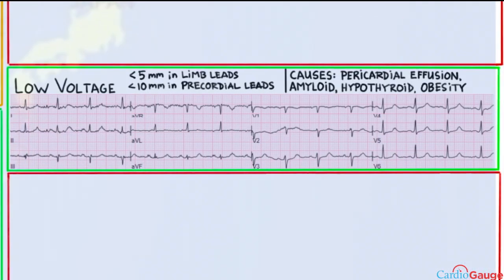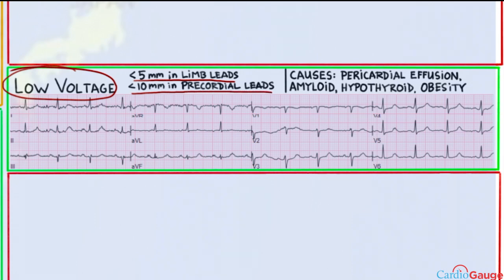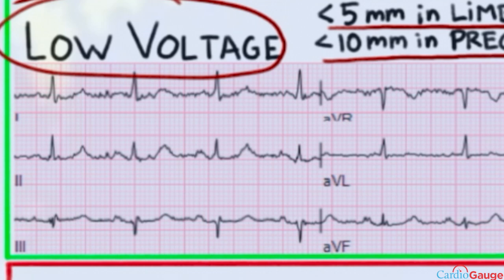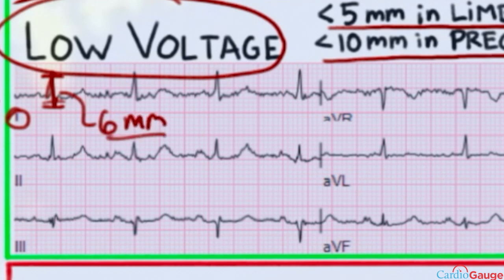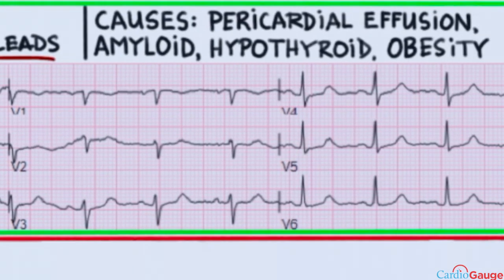Here's our last item for level one — low voltage. Low voltage is defined as less than 5 millimeters in limb leads, or less than 10 millimeters in the precordial leads — it only needs to meet one of the two criteria. In the ECG, lead one is about 6 millimeters, so it doesn't meet criteria by the limb leads. But over in the precordial leads, the largest complex is probably in V4, and that's slightly less than 10 millimeters, so it does meet criteria.